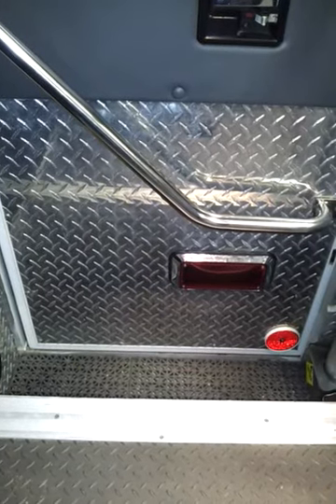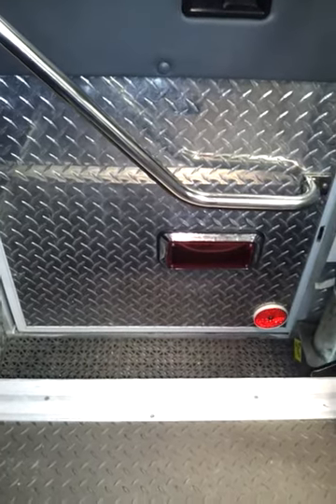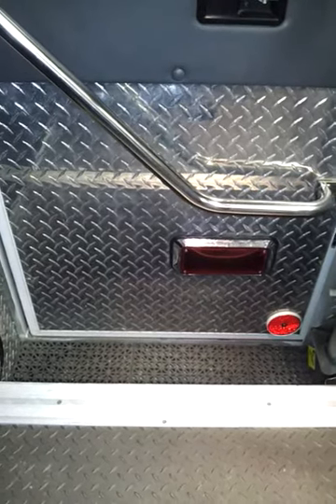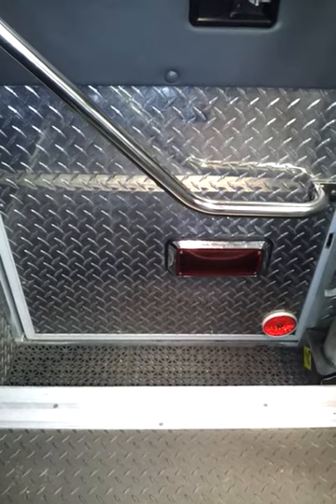Alright, I'm going to do a little tour of what an Advanced Life Support Ambulance has in it. I'll also show you a few other things.